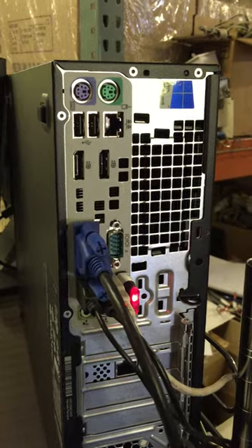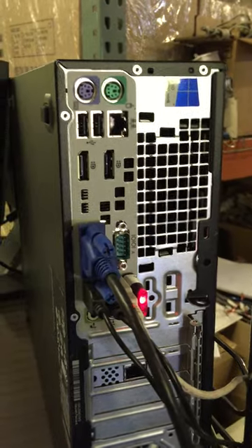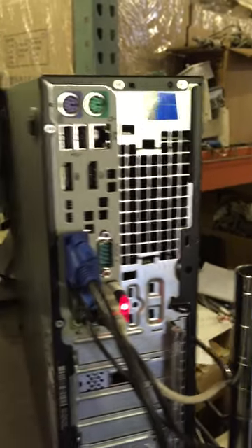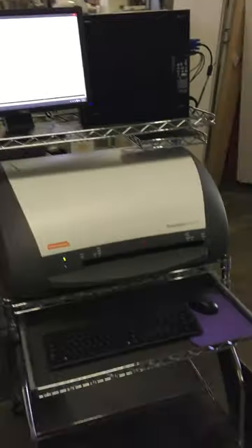Then there are power cords, obviously, for the computer, the monitor, and the scanner itself. It's a very nice cart. You don't get it, obviously. Sorry about that.